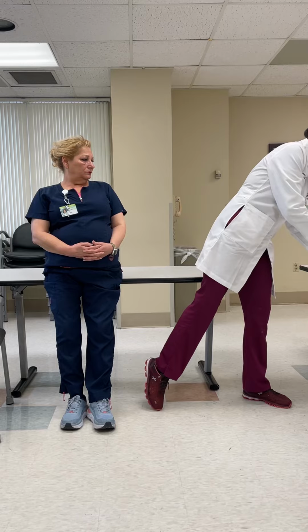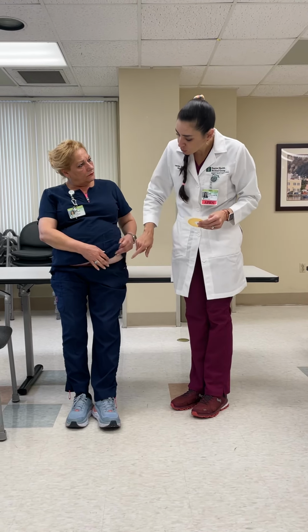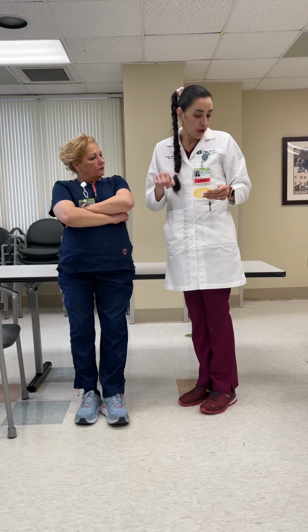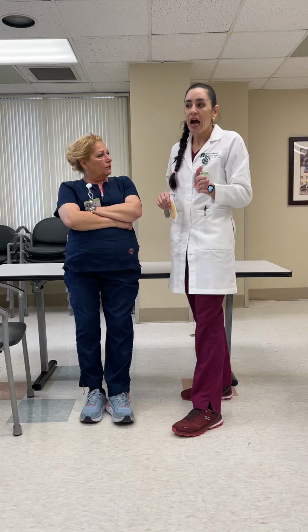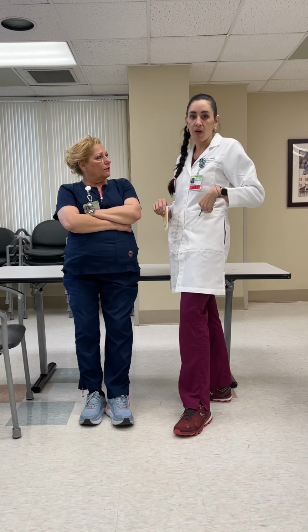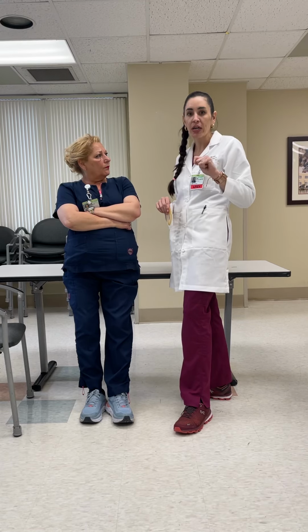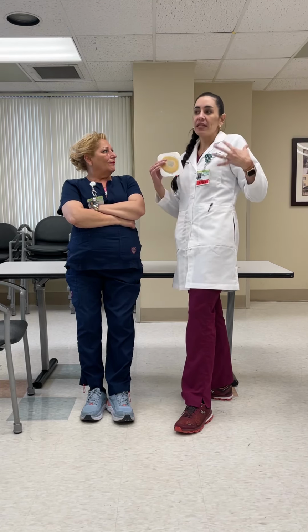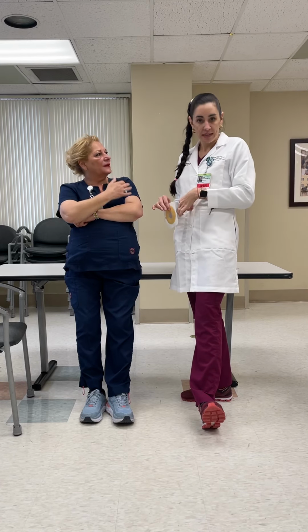Once we see that this is the right ostomy site, and we're gonna apply it for the patient, after we mark with the marker, we usually get a Tegaderm or a hydrocolloid, and we protect it until the day of the surgery to avoid the marking coming off. That's why we're using a permanent marker. And we also explain to the patient that if they take a shower, they have to make sure that the mark stays there.